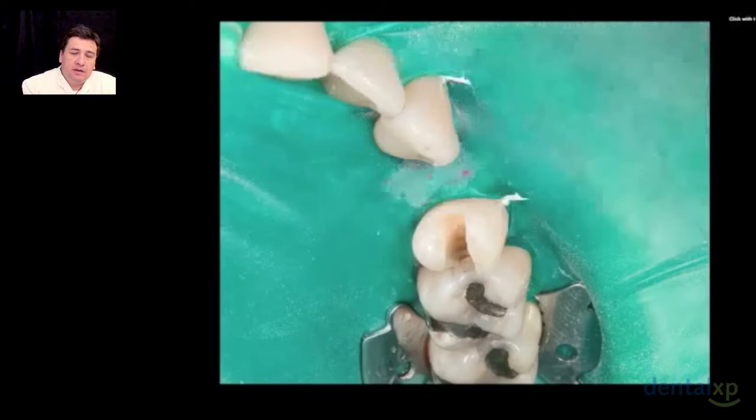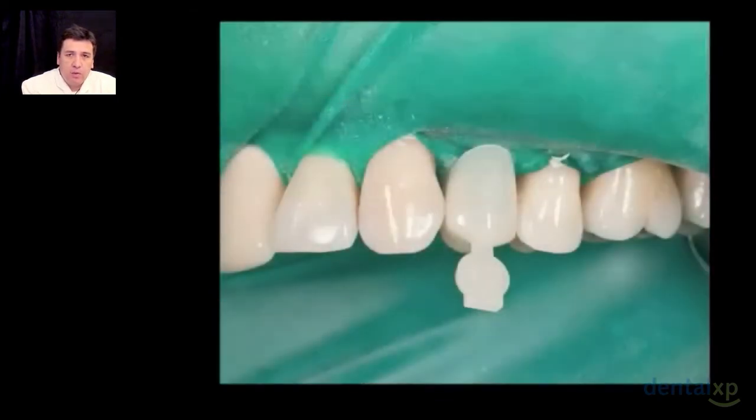isolate the wound, and also we will isolate the tooth that we want to fill and to hang on that the new crown or the provisional crown. For that, we must proceed in the very strict way of a filling process.